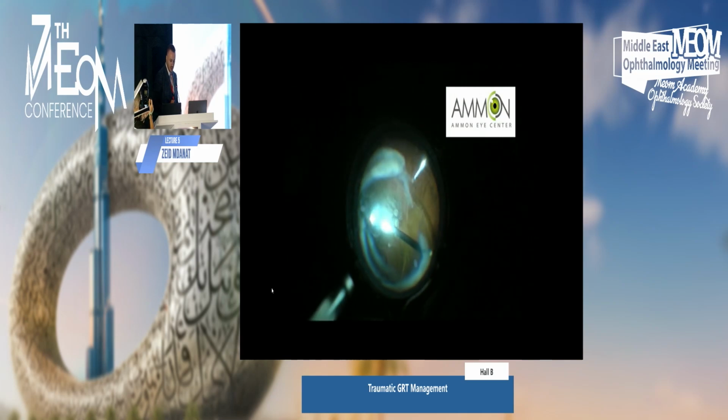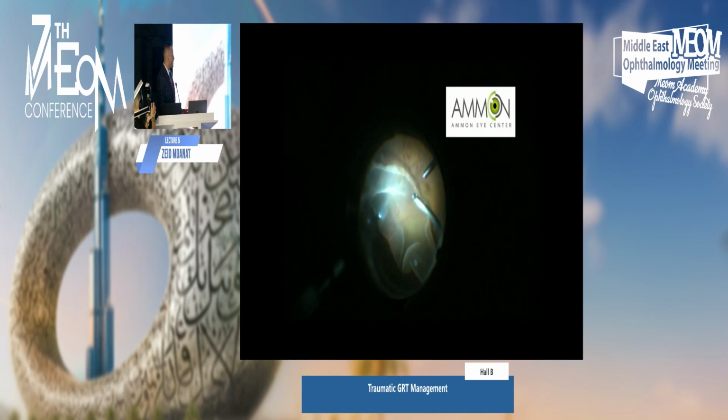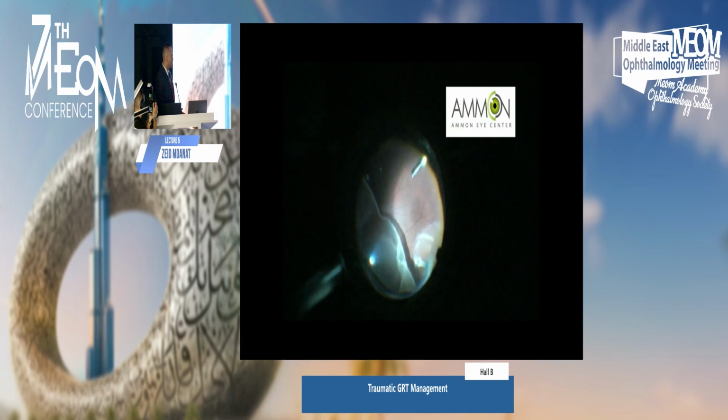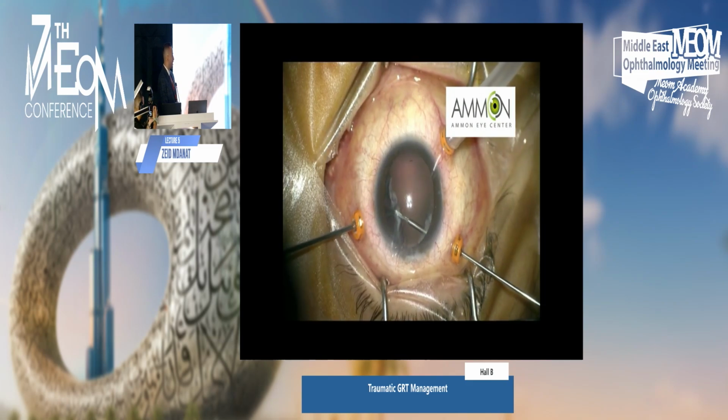So you can see I'm doing the vitrectomy. The remnant fibrotic capsule was floppy. I'm trimming and shaving the vitreous over the edge of the detached retina. I think it's very important to remove as much vitreous as possible, as close to the edge as possible, with care and precision. I tend to lower my vacuum here.